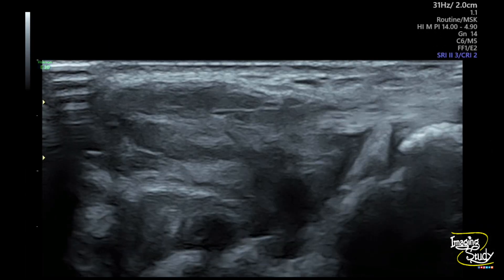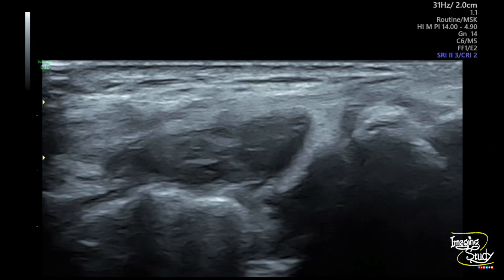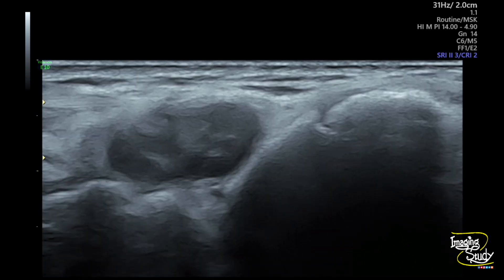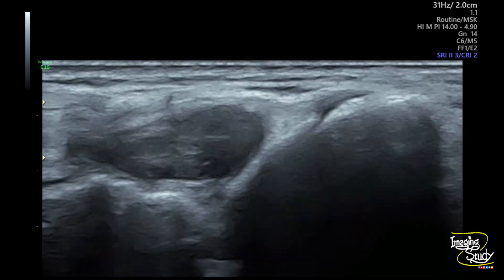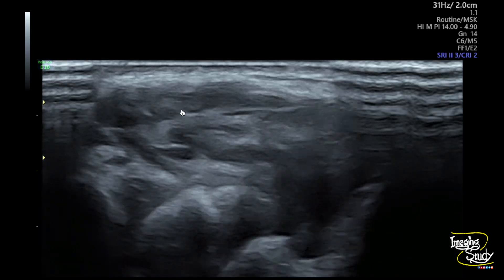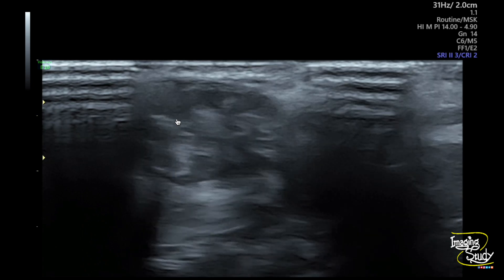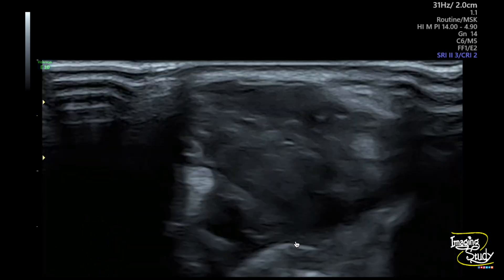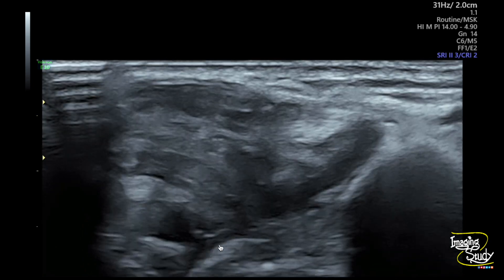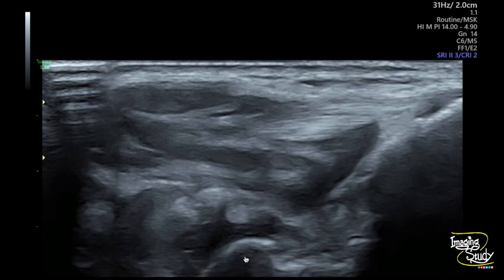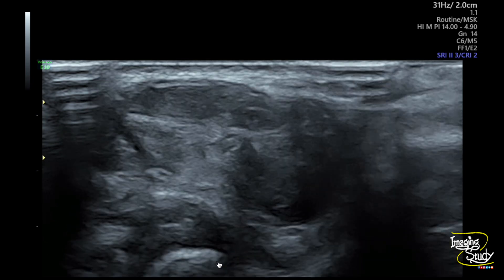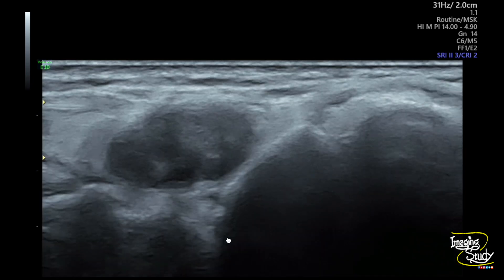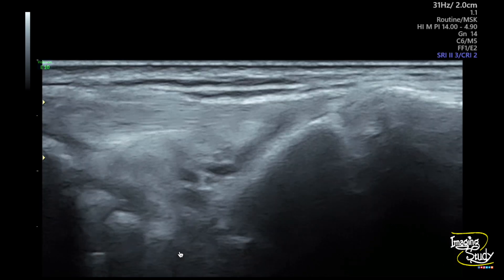Here you can see the high frequency ultrasound of the wrist joint from the dorsal aspect. You can see a heterogeneous hypoechoic area. If we check carefully, there is an extension of this hypoechoic area to the joint cavity. This is the scapholunate joint and it is a very common site when it is at the dorsal aspect.